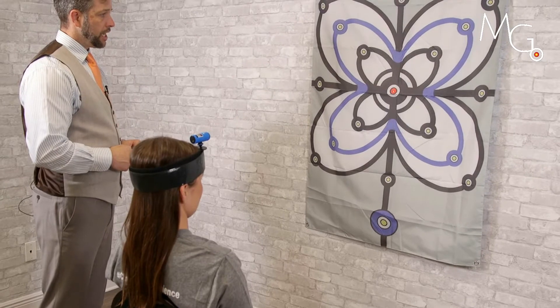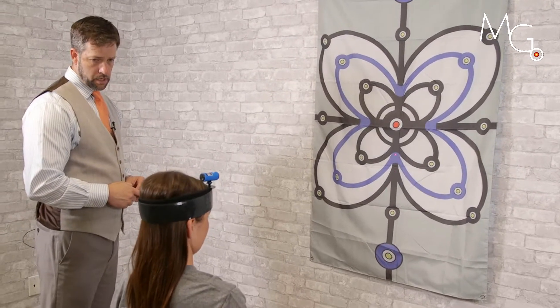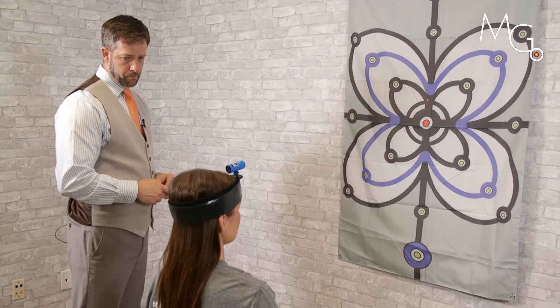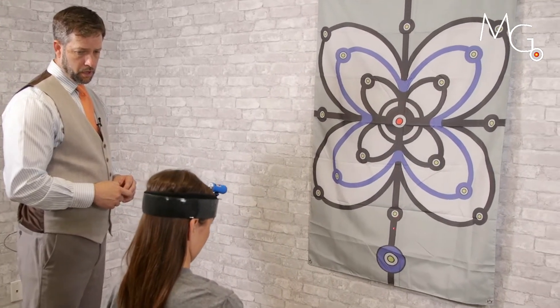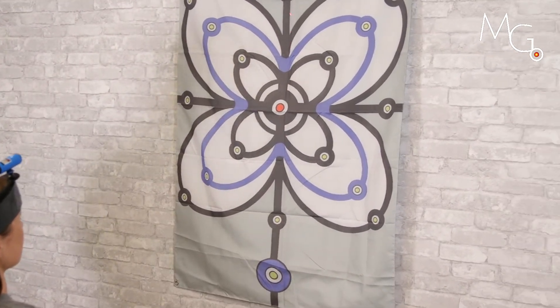The patient can do flexion and extension activities, and the clinician can be making simultaneous assessment.